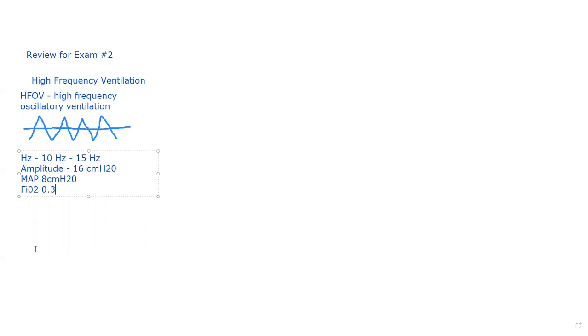Okay, next we have chest x-ray. We talked about that. To get a good mean airway pressure on an infant, you go according to chest x-ray and rib expansion. On adults, you just look for the degree of opacification to improve. So there is no rib level of the diaphragm with adults. You're just looking for the x-ray to show less opacification.